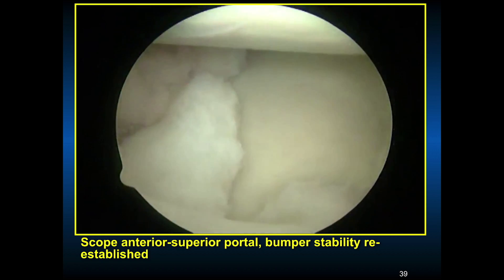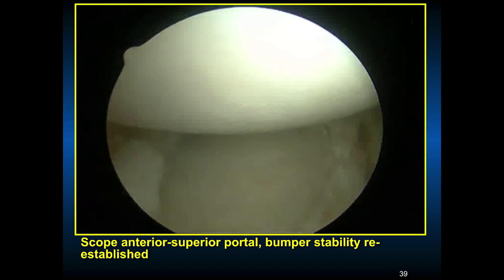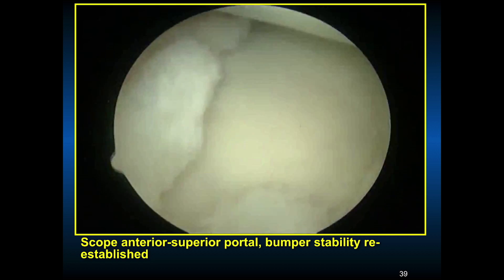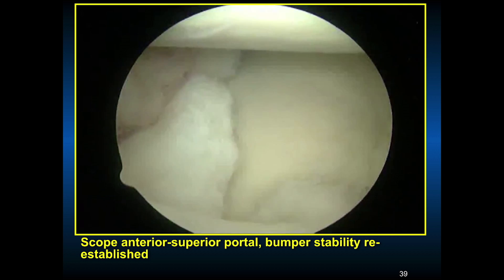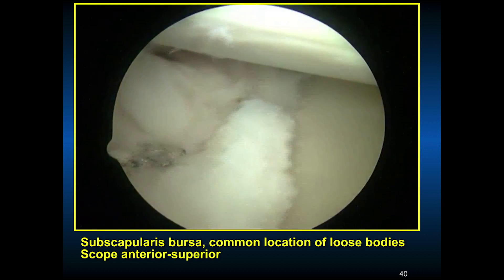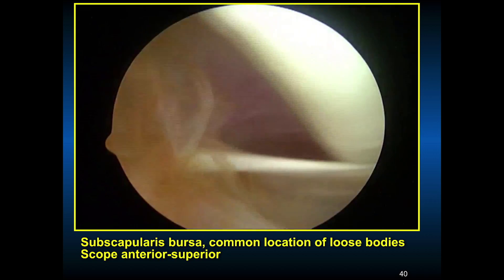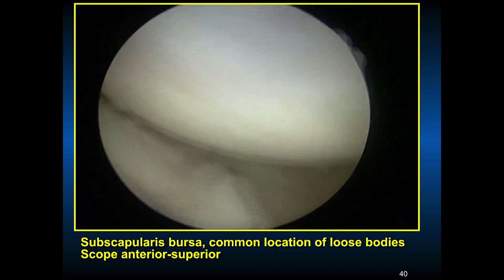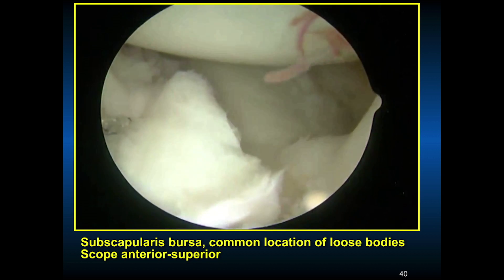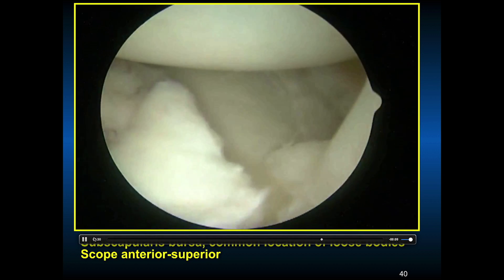Different sutures can be used — these are non-absorbable sutures. Make sure the sutures are tied with good tension but respect the tissues; you don't want the suture to tear through the tissues anteriorly. Grab capsule and labrum and re-establish the bumper effect. This is the subscapularis bursa, a common location of loose bodies. Looking down from the anterior superior scope you can see the middle glenohumeral ligament, the biceps, and the bumper of the anterior repair — excellent re-establishment of the bumper effect of the labrum and stability.